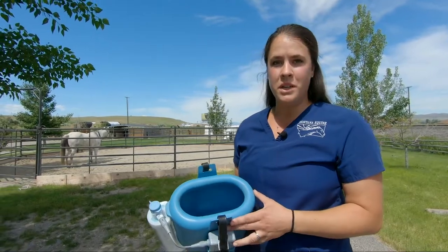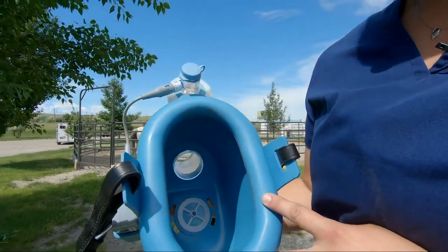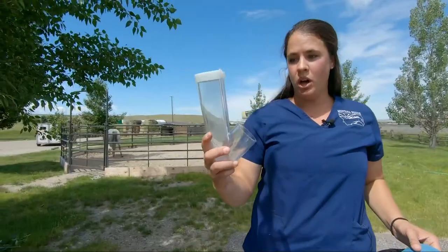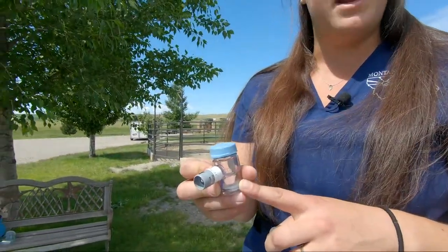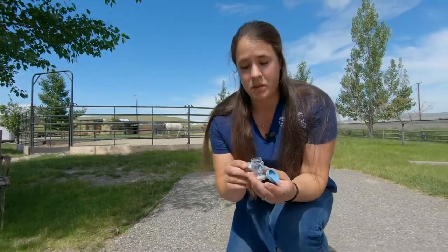Once you take off the FlexiNeb, you'll want to clean it. Sometimes there will be condensation within the mask itself — you can just wipe it out with a clean cloth and let it air dry. The mask will also come off so you can air dry that out. You can wash it with just warm soapy water and let it air dry. Remember that plastic cap — that's because you have to wash this cup every time after you do a medication. If you do several medications, you have to wash the cup in between each one.